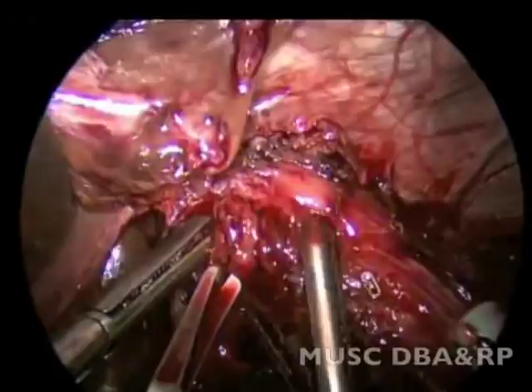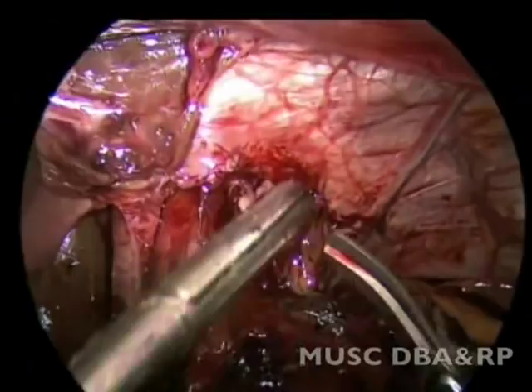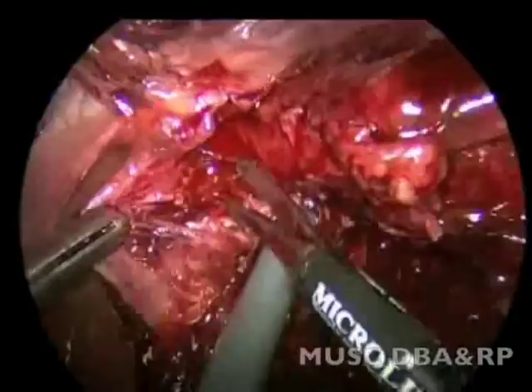Similarly, some anterior scar tissue is released around the esophagus. An entry into the mediastinum is confirmed. The last crural stitch hugging the esophagus is sharply taken down.